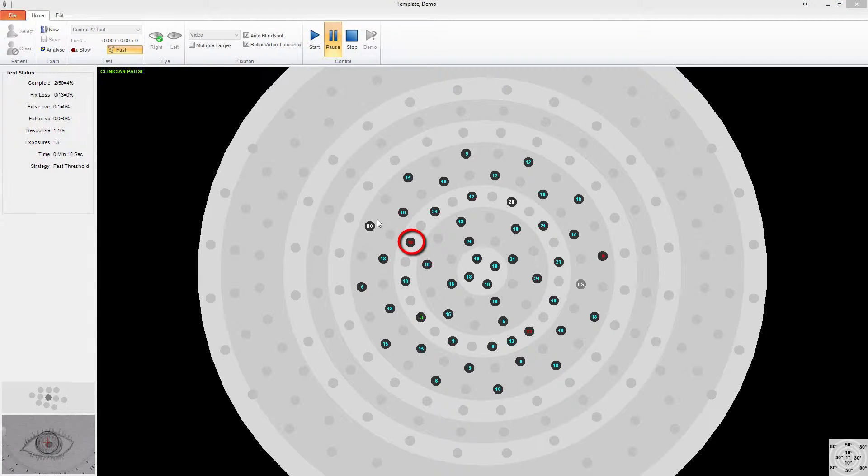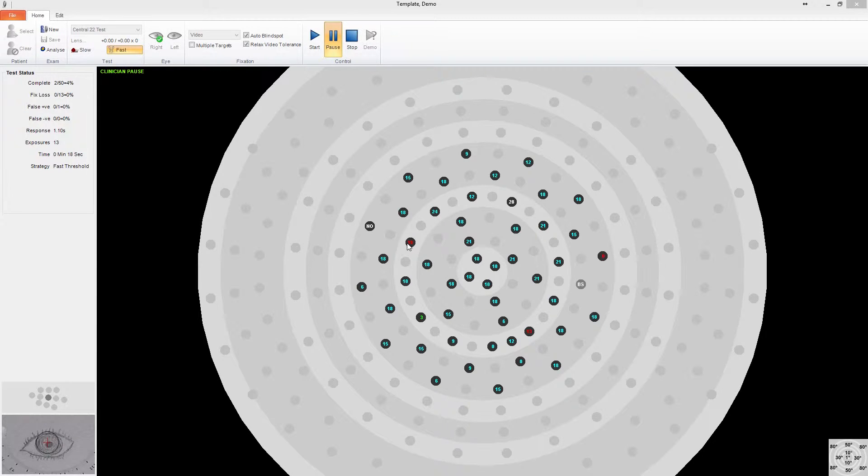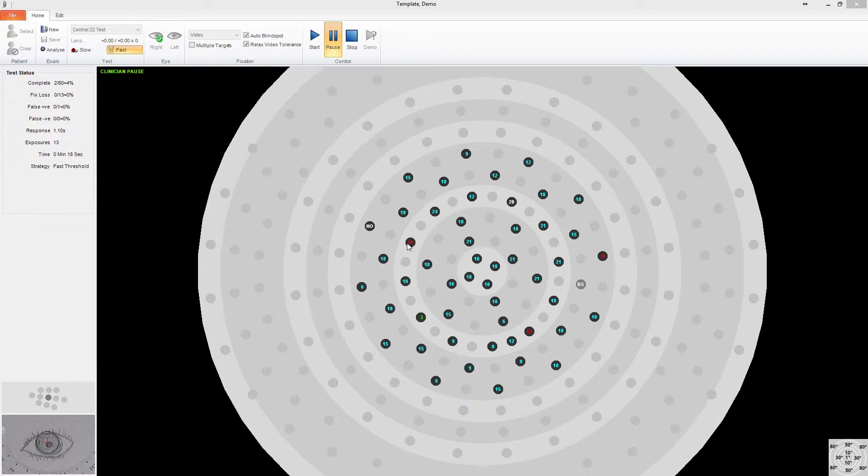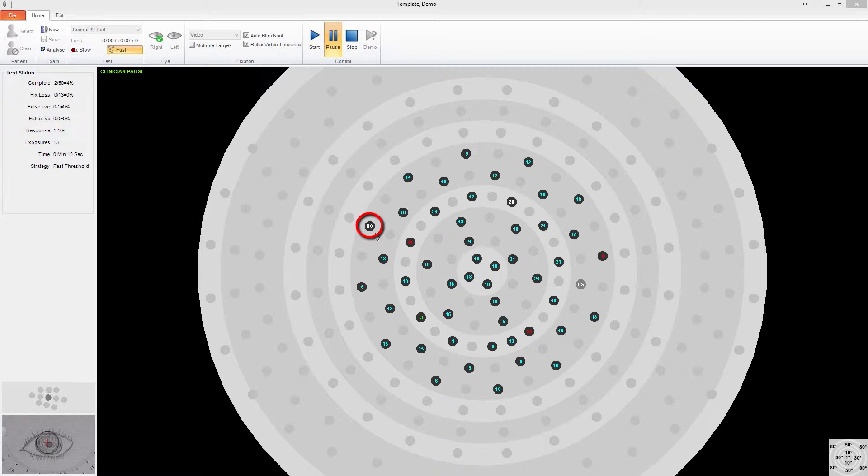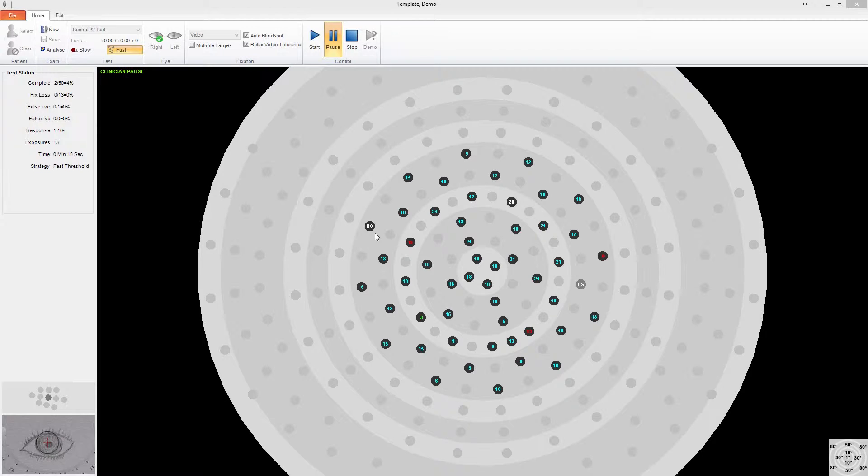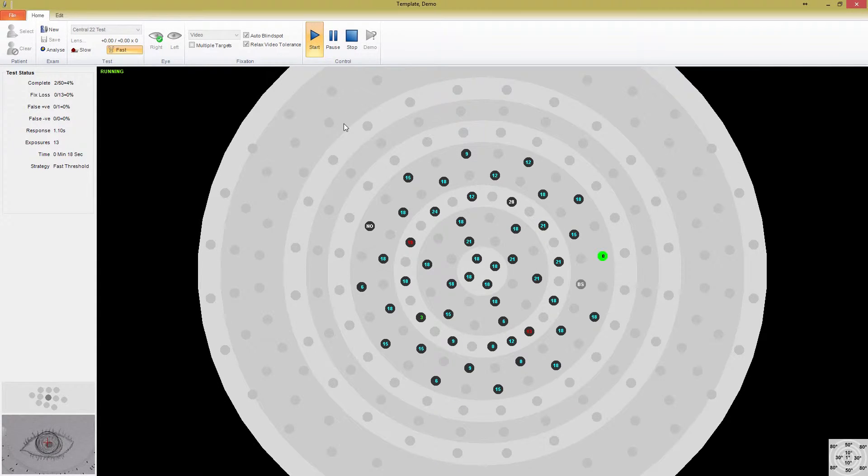The numbers shown in red are points that have previously been exposed but not seen at that level. The numbers shown in green are points that were seen at their last exposure. And points in white have already completed and the number is a threshold value that they've completed at. For example, this point that says no was exposed at the brightest level and still not seen, so it completed at a not seen value. If I start the test again, you can watch the other points complete.